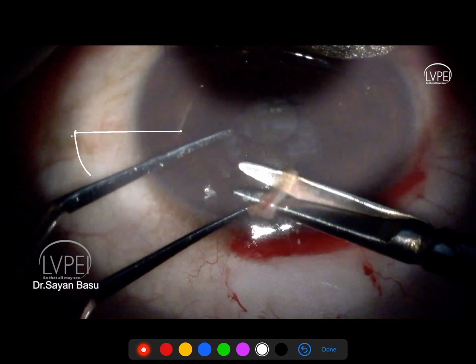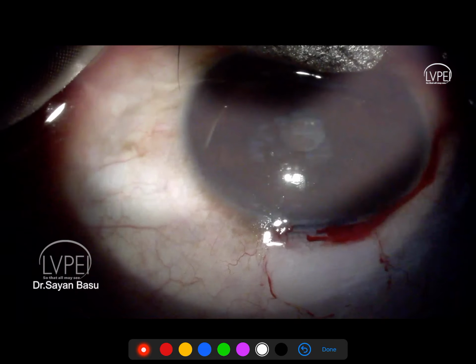Just keep a little bit of fluid in it, and just make sure that the limbus is floating in it and is not dry. So the limbus should not be stuck to the edge of your bowl. This is very important. And so there should be enough fluid that it floats, but there should not be so much fluid that you lose your limbal piece, because when you recover the limbus, you are going to look at it either with the naked eye, and it's very small, only 3 to 4 millimeters, or under the microscope where there's a lot of reflection because your bowl is made of steel and you may not be able to see it. So the fluid also needs to be minimal. There should not be too much fluid in your bowl.